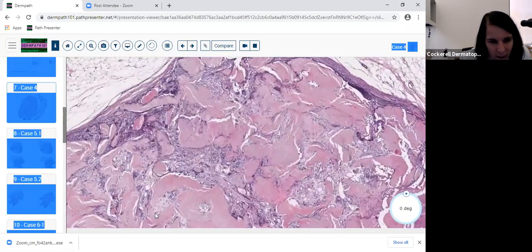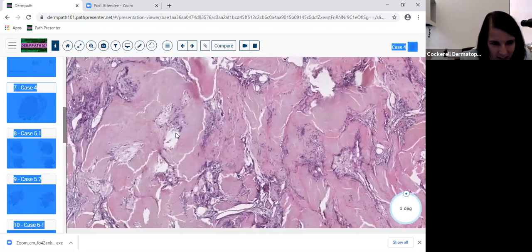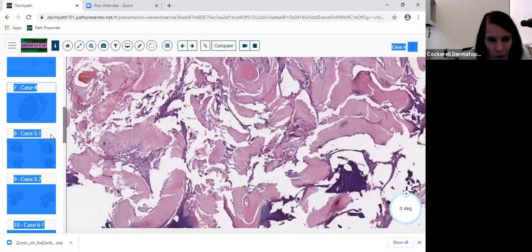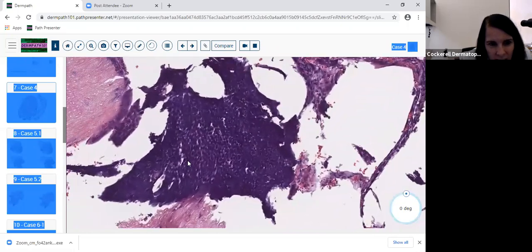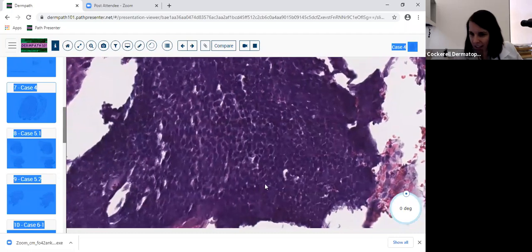I looked pretty hard. You can see dystrophic calcifications inside the cyst, and you can also see that with a pilar cyst. So don't just see calcifications and jump on pilomatricoma. Look around for the basaloid nests. And this is a benign process, even though if I only had this on a shave, I could get very confused. I might think this is a basal cell.